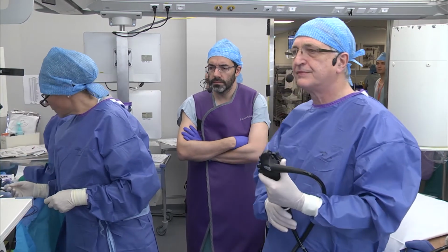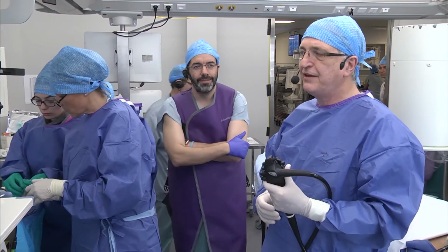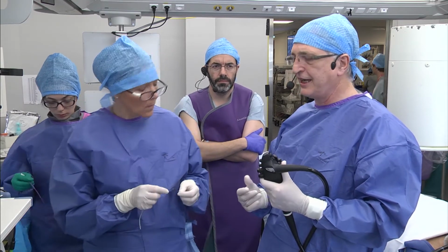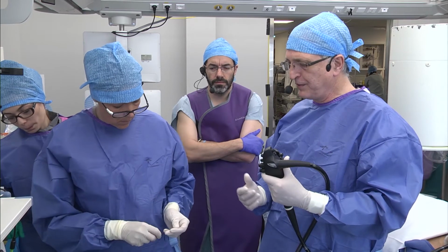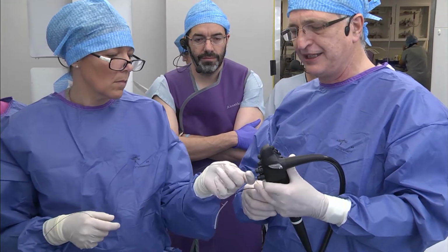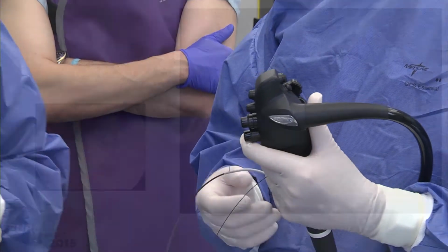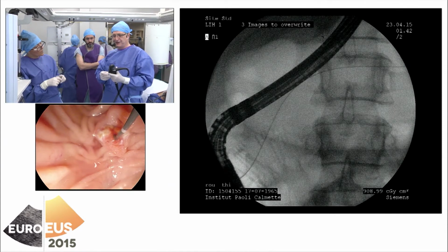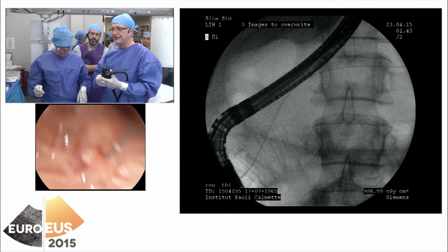One question. Do you perform a prophylaxis of post-ERCP pancreatitis in this case or not? Yes, of course. Every time we work on the pancreatic duct, we give NSAID to the patient, and the patient has received intrarectal diclofenac because we knew that we would work on the pancreatic duct. The other thing that we will do here, but for a therapeutic purpose, is the placement of a pancreatic stent to prevent post-ERCP acute pancreatitis. But in this case, we don't want a stent without proximal flaps, which will spontaneously migrate, but we use a stent with two flaps, as you see, which will stay in place for 6 months before being removed. And I think that in this particular case, after 6 months, if we can place two stents, I would not place a second one.